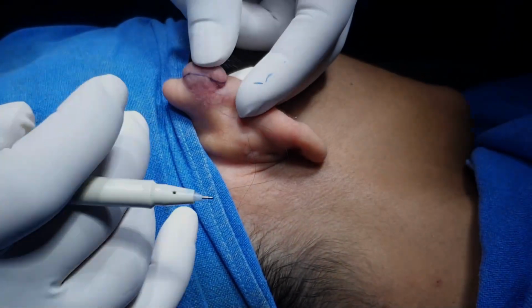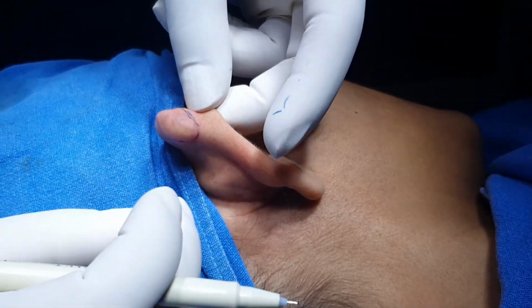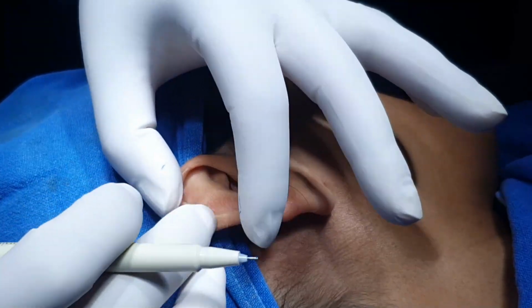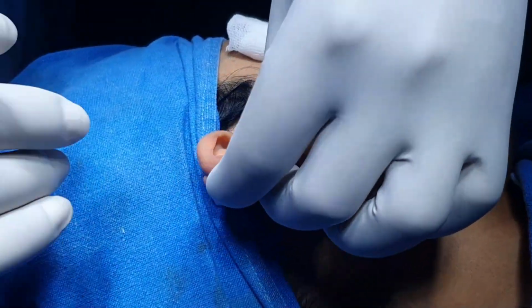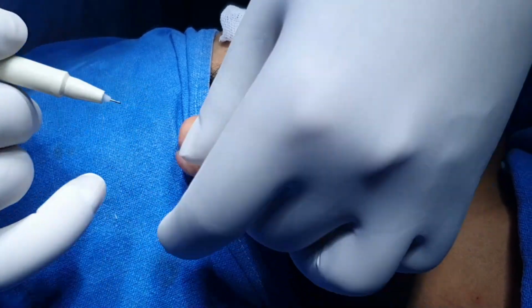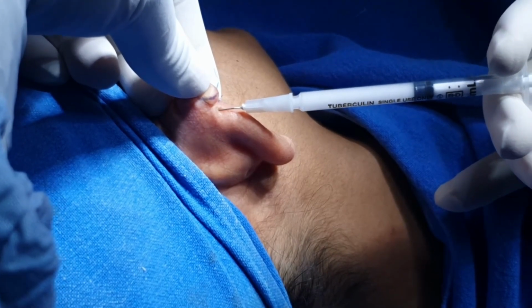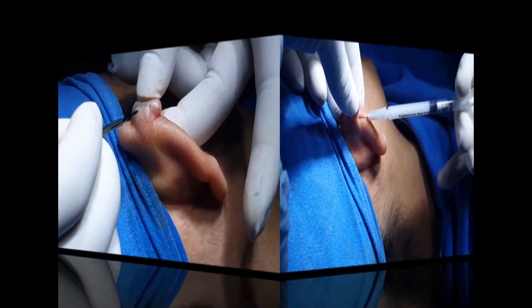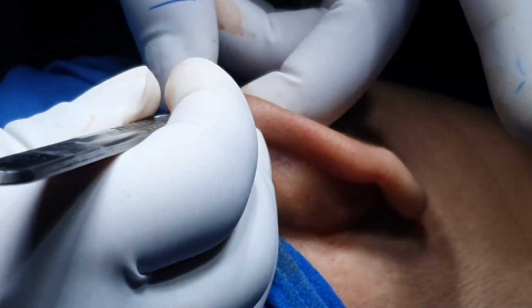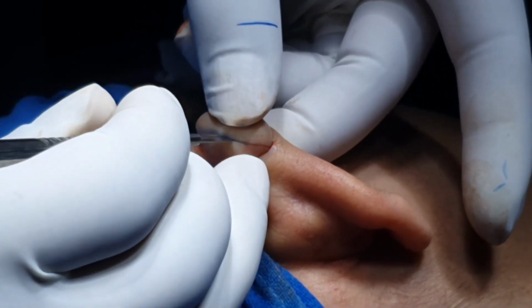Lesion here, and I will try to preserve this much of the skin, otherwise it is very difficult to cover the defect. And this is basically the starting point of the dumbbell part of the keloid. See, the part is projecting here also, so we will excise this much part here. I try to preserve this much amount of the skin to cover the defect. So starting from here, this is a sort of intralesional excision.